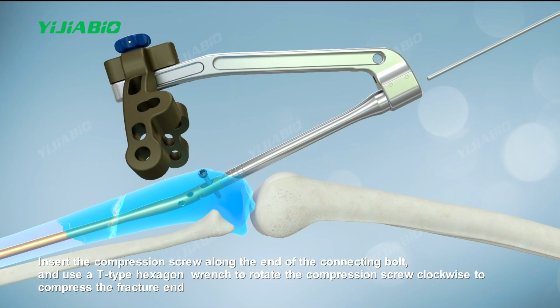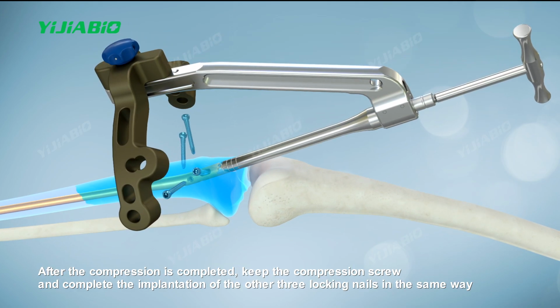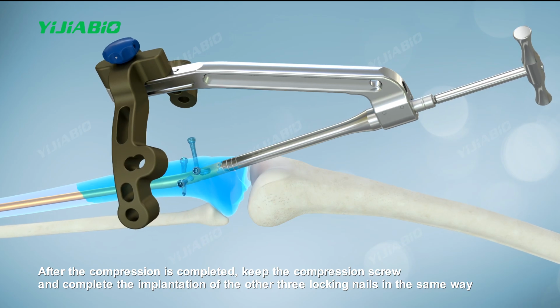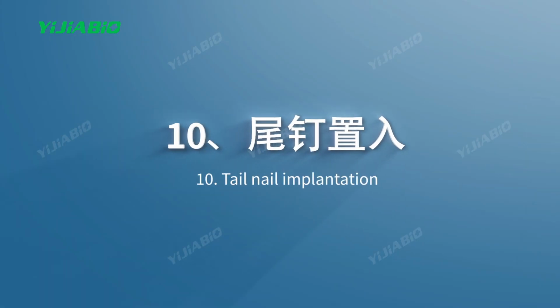Insert the compression screw along the end of the connecting bolt, and use a T-type hexagonal wrench to rotate the compression screw clockwise to compress the fracture end. After the compression is completed, keep the compression screw and complete the implantation of the other 3 locking nails in the same way. Ten, tail nail implantation.